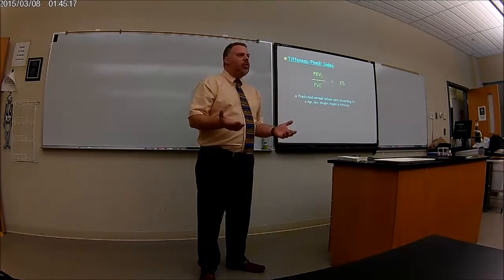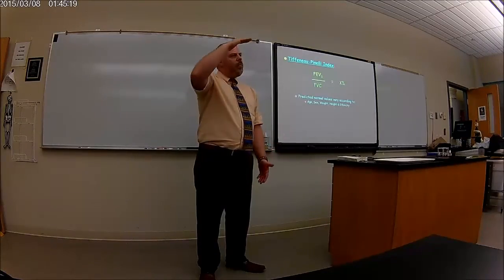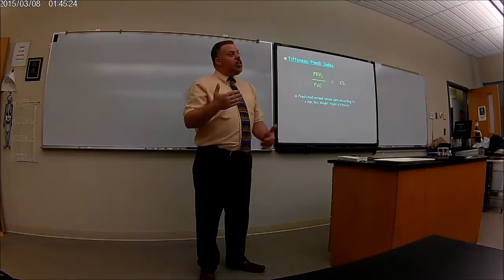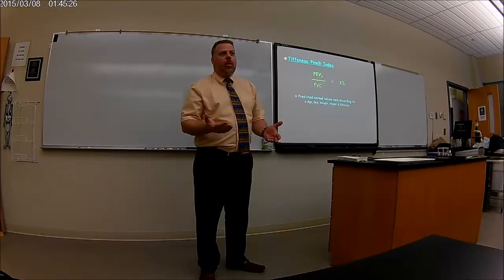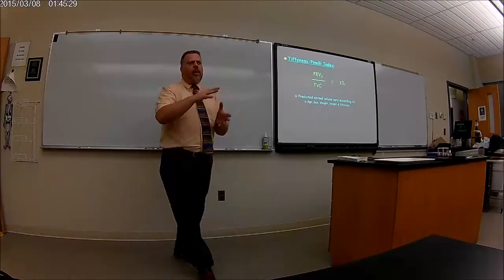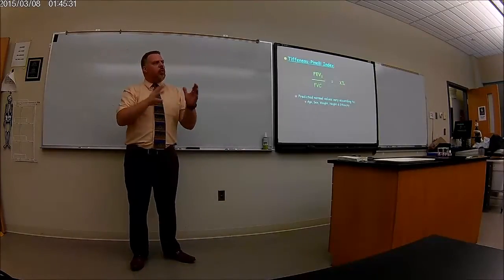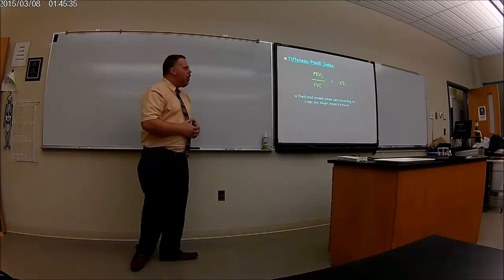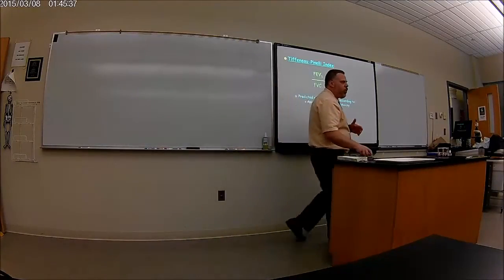Or let's say 5 liters. Okay? But it's different by height, it's different by age. It's different even if you've smoked or not. Okay? It changes, but they have this formula that says what you should be, the predictive value. Okay? But it's changed for each person.